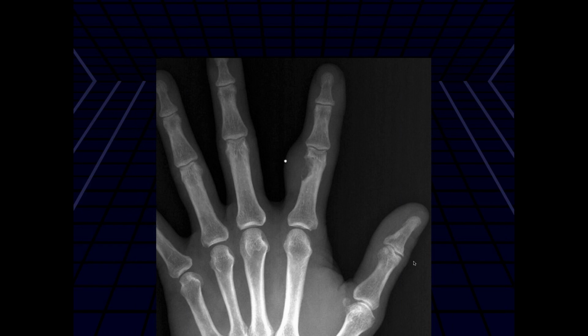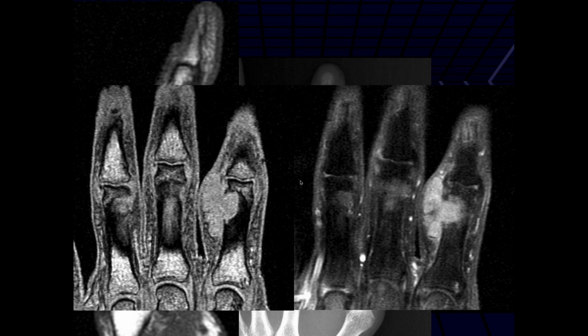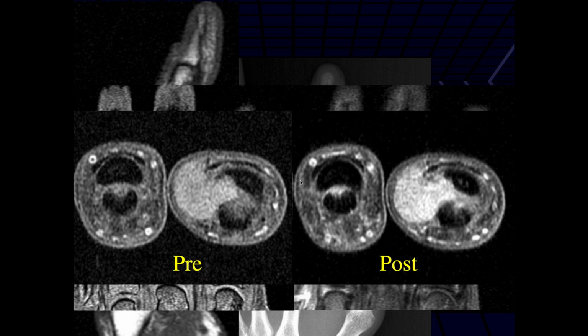You can see a large extraosseous soft tissue mass or soft tissue thickening with erosions of the adjacent proximal second phalanx distally. You can see the skin marker right there, maybe an overhanging edge there. I'd still be worried about some type of tophaceous gout. There's the MR, much more clear on the MR. You can see that soft tissue eroding into the distal aspect of that proximal phalanx, and it's enhancing, so consistent with gout.